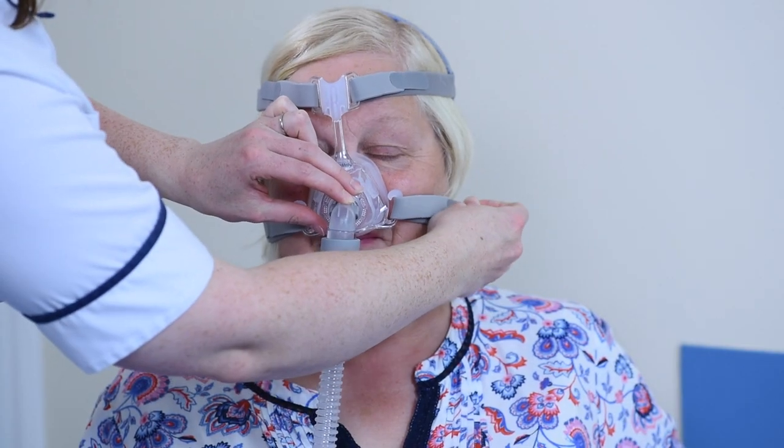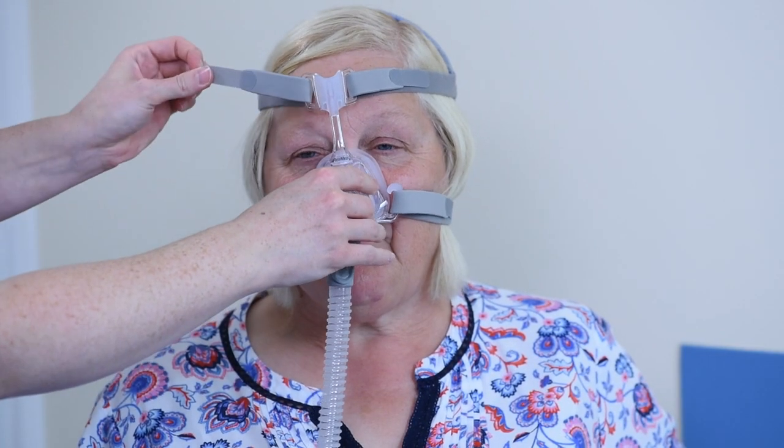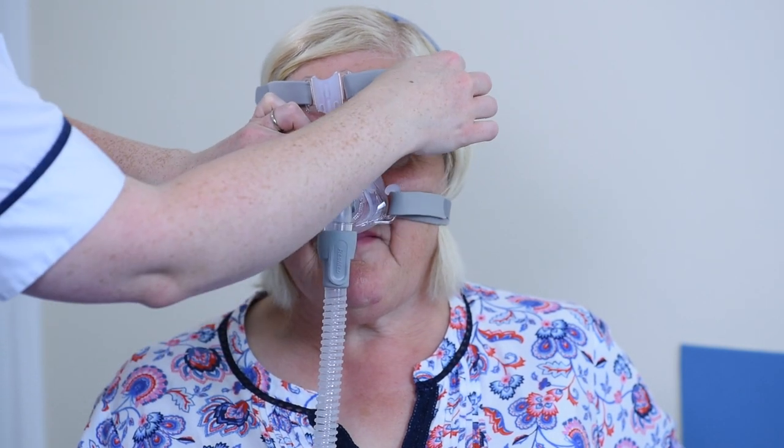Keeping your mask clean will also help with mask fit, and you can see our mask cleaning guide to help with that. If you have a nasal mask, we may suggest that you try a full face mask.